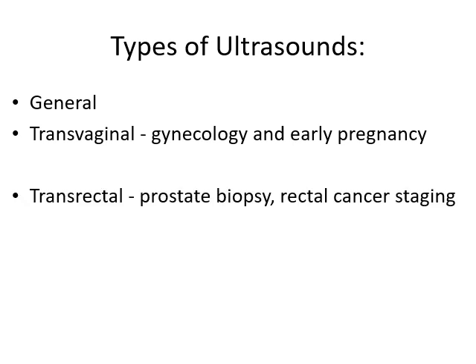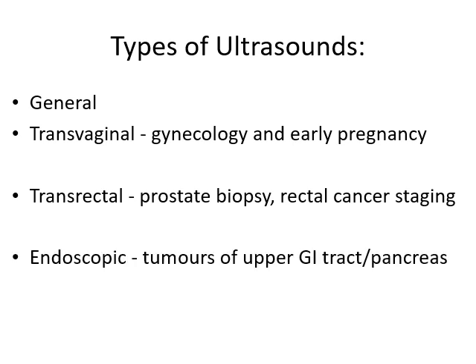All right, now another one that you may have is if you go in, you've had a lot of problems with your stomach, you think you might have an ulcer, or you've got a whole bunch of pain in your side, they'll give you an endoscopic ultrasound. So this is going to look at stuff in your upper GI tract, see if there's any tumors or anything in there, or it can also extend down into your pancreas so they can take a peek there.